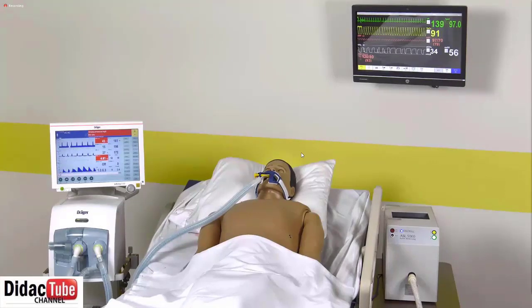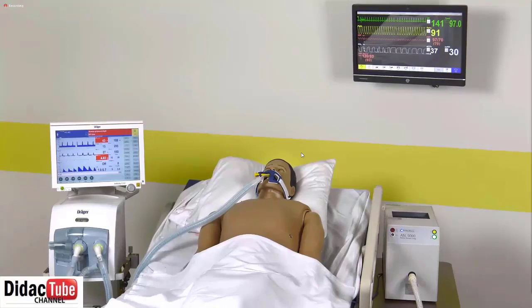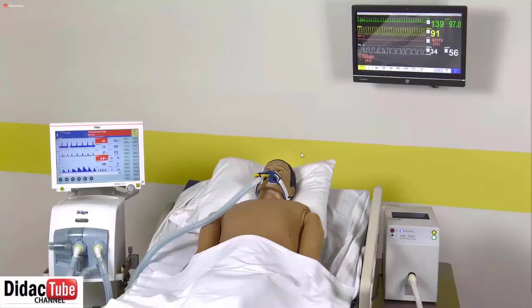The ASL5000 is producing not only inhaled tidal volumes, but exhaled tidal volumes as well. So if you were to simulate a spontaneously breathing patient in LEAP and you place your hand over the mannequin's mouth, you will feel that exhaled tidal volume.